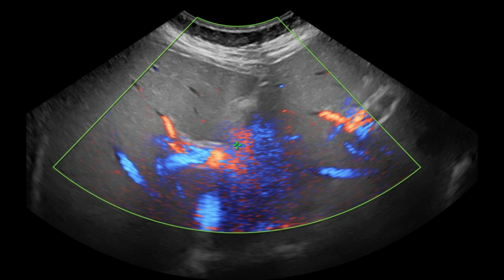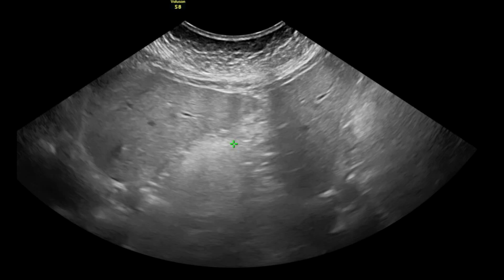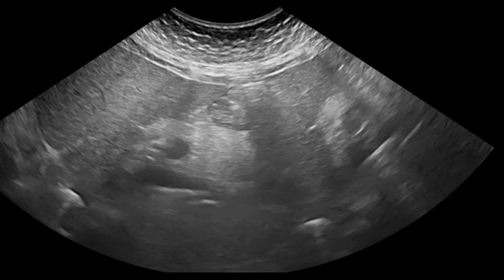Now I will tell you the real scenario. What happened? After finishing the morning session, I went for lunch, and at that time echo was being done by our cardiologist. After half an hour, I came back to see the remaining 3 patients for ultrasound abdomen. The first patient was done, and you are seeing those images. The same thing happened with the other 2 patients, all of them having duplication or mirror images everywhere.